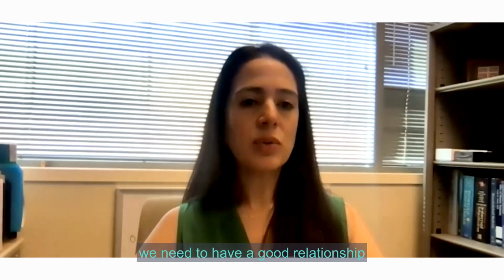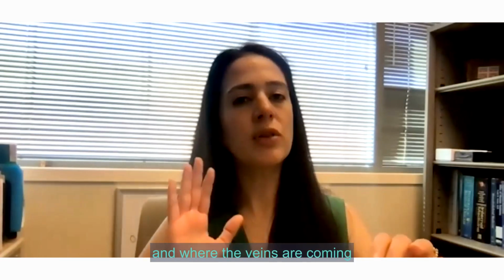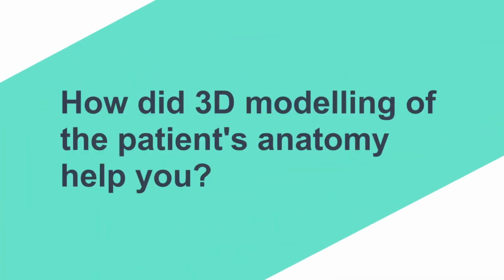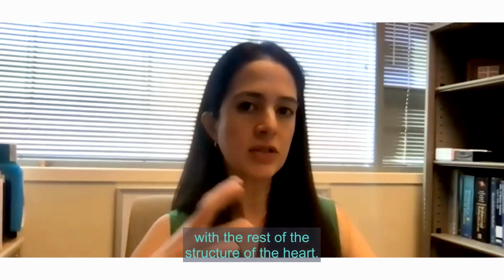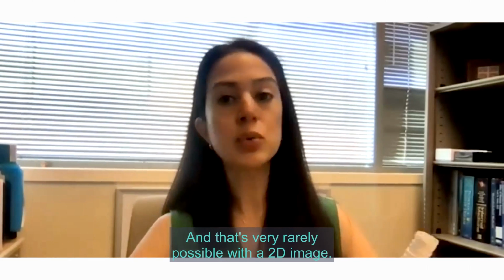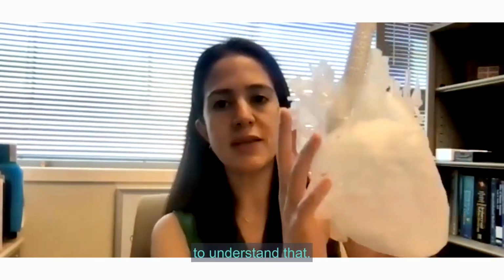And for that, we need to have a good understanding of the relationship between a hole that is in the heart and where the veins are coming in, so we can intervene to fix them. The interesting thing with this patient is we need a 3D view of how the veins come in relationship with the rest of the structure of the heart. That's very rarely possible with a 2D image. So we need a 3D view of all the structures to understand that.